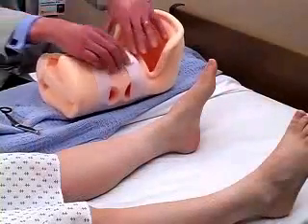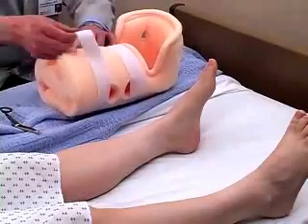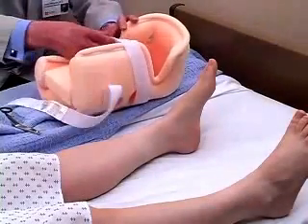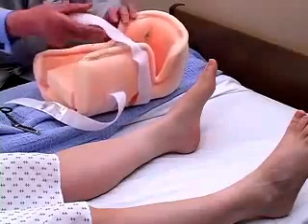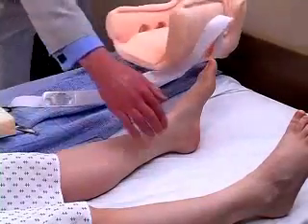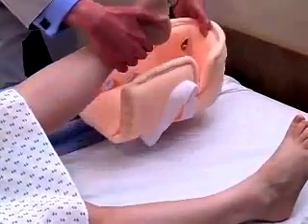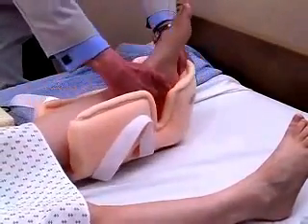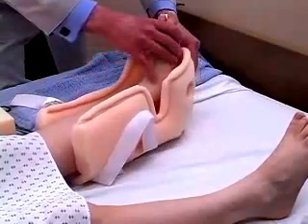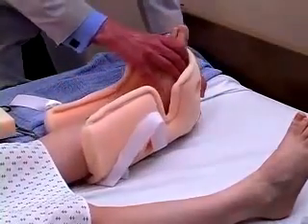The application and fitting of the Heelift suspension boot is an easy and efficient process. The fitting is simplified because one size fits all. Start by opening the boot and removing the spare pad. Next, lift the leg and place the heel deep within the boot so that the foot is held in neutral dorsiflexion. The flaps are then closed, leaving some space between them for ventilation.